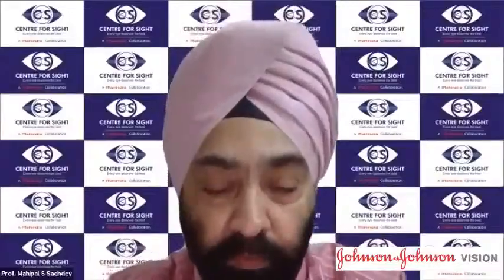Partha also wanted to say something. Yes, sir. Professor Chi, I really congratulate you on the wonderful teaching videos that you have had. And I've used your technique in 5 cases. The first 3 cases were utter failures. I absolutely failed and my first hand ripped the capsule to the end and I had a rip and I had to abort that case and do a lensectomy, vitrectomy and then a scleral fixated IOL.